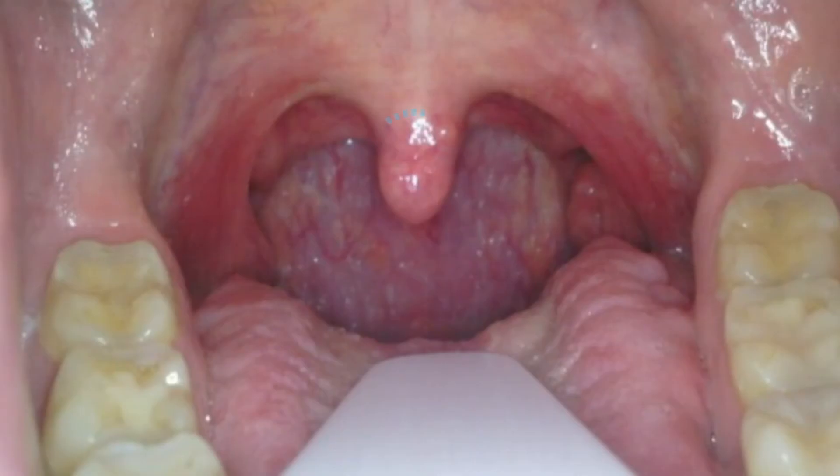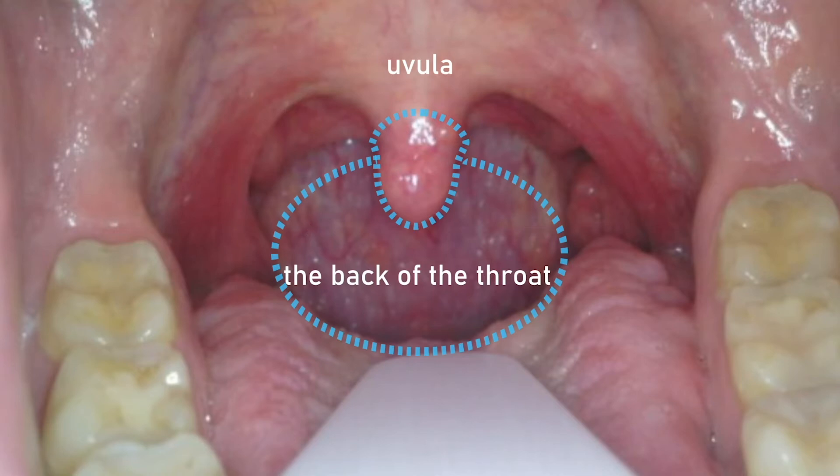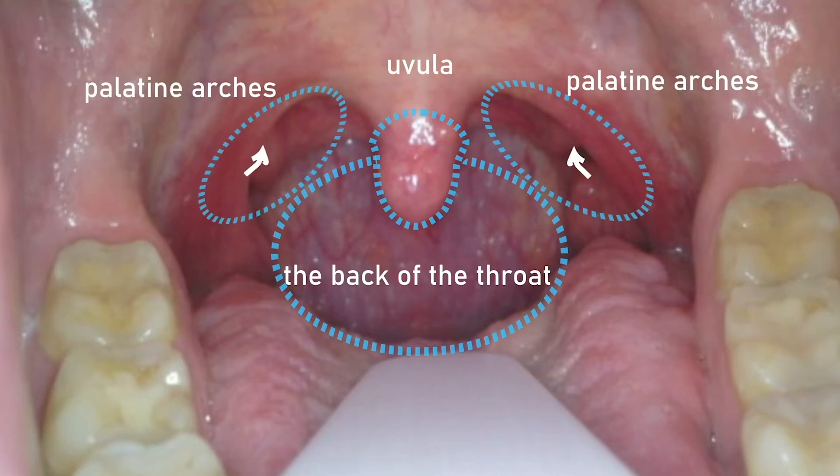In order for the image to be considered diagnostic, it should include the uvula, the back of the throat, and palatine arches.